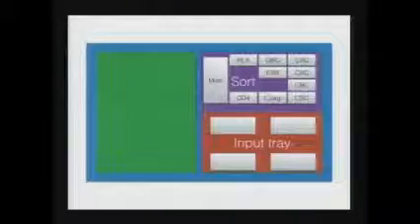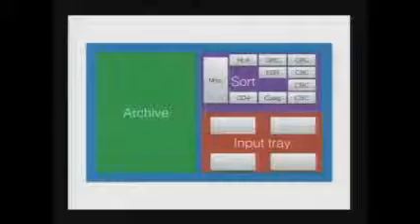So there was an error, and based on this error, what we did was we looked at the root cause. The root cause is the current system did not have a procedure of receiving and sorting samples. So we brought in a procedure. Now this is the place where we receive hematology samples either from the pneumatics or walk-in, and we decided we'll keep a table with 3 trays. And the 3 trays are an input tray, a sort tray, where we have multiple, and then we have an archive tray.